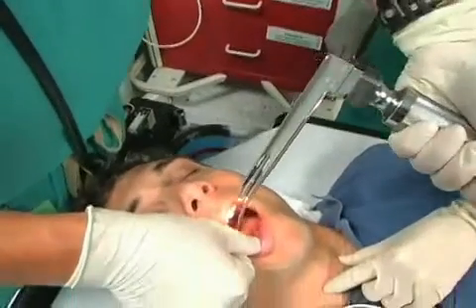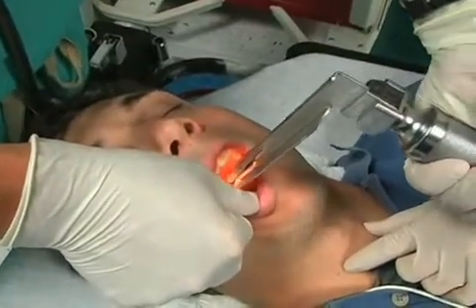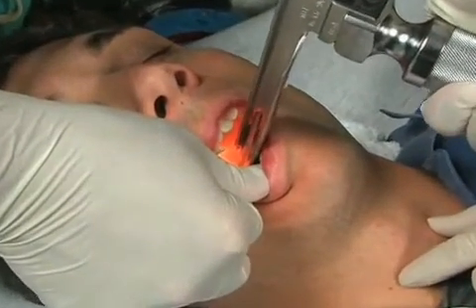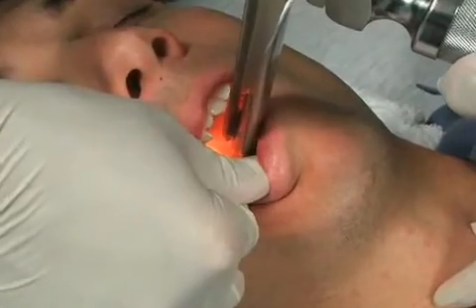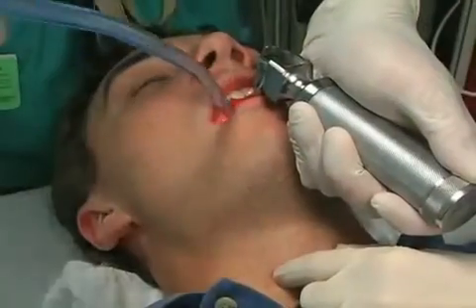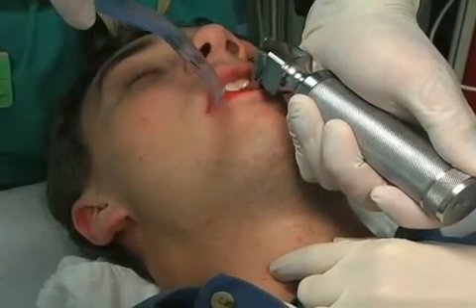After drug administration, cricoid pressure should be applied to prevent aspiration and enhance visualization. Technique using the straight blade is first demonstrated with the handle in the operator's left hand. The blade should be inserted on the right side of the patient's mouth and slowly advanced with the operator's eyes in search of the epiglottis. Suctioning may be required to clear secretions from the posterior pharynx.